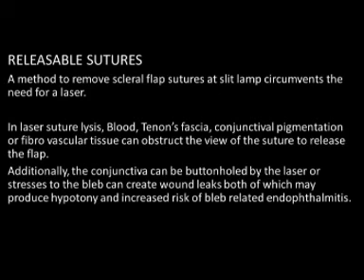Releasable sutures, a method to remove the scleral flap sutures at the slit lamp, circumvent the need for a laser. In laser suture lysis, blood, Tenon's fascia, conjunctival pigmentation or fibrovascular tissue can obstruct the view of the suture to release the flap. Additionally, the conjunctiva can be buttonholed by the laser, or stresses to the bleb can create wound leaks, both of which may produce hypotony and increased risk of bleb-related endophthalmitis.